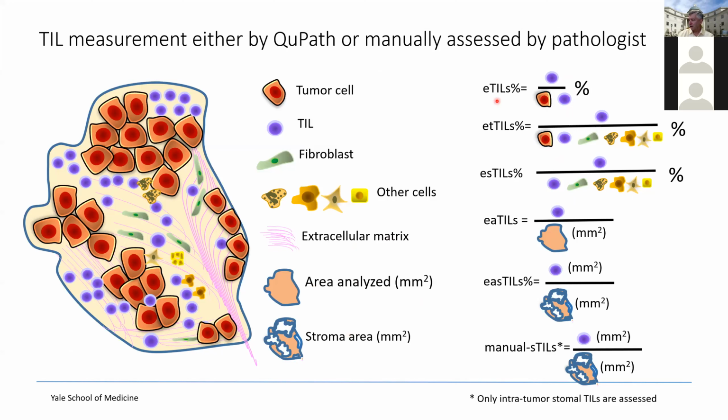variables. We call these the variables, and the algorithm we called CNN11, for convolutional neural net 11, which just meant it was the 11th build of that algorithm. And we can make that publicly available, and in fact have made that publicly available. And in fact, as Balazs will point out to you, his algorithm that we made publicly available in melanoma has now been used by other groups and shown to be validated without either of us participating in their study.